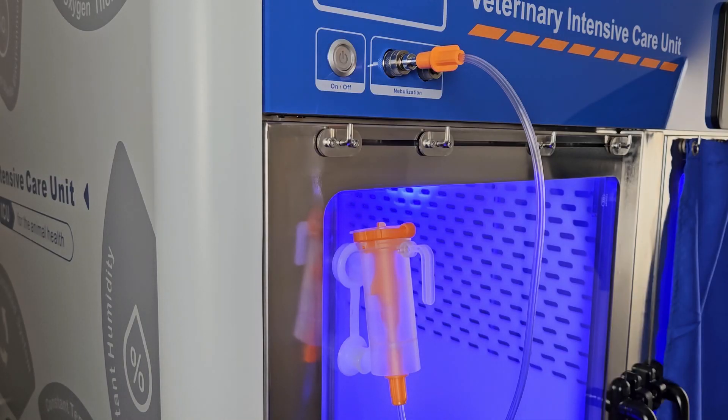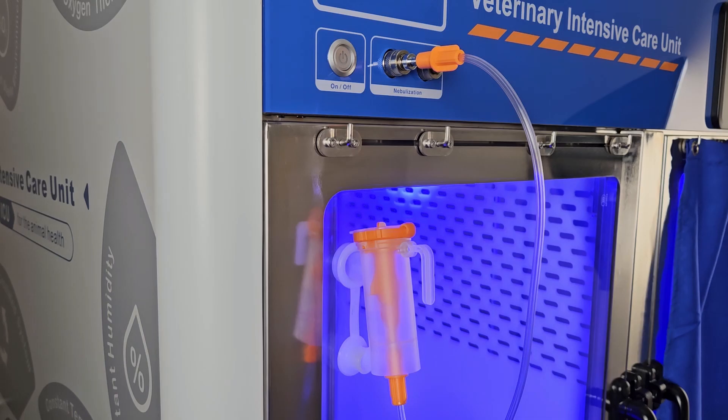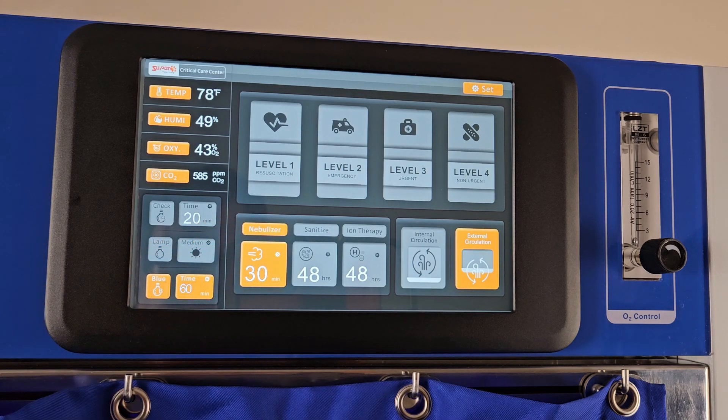A nebulizer can be attached to the nebulizer ports and placed into the port on the cage door. Be sure that the nebulizer is not filled past the max fill line. To turn on the nebulizer, press the nebulizer button and set the time for automatic shutoff below, up to 60 minutes total.